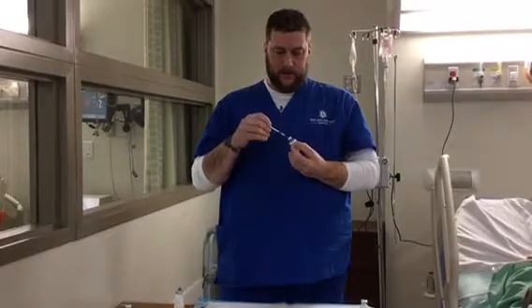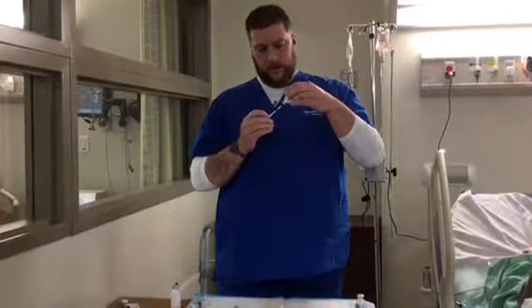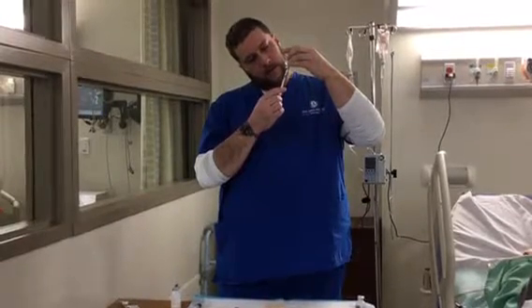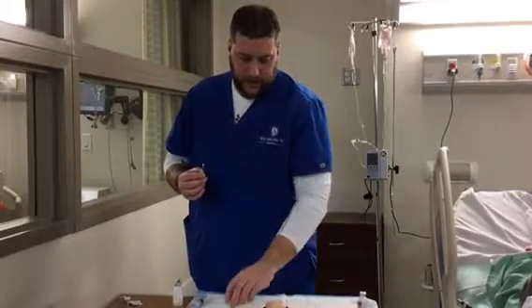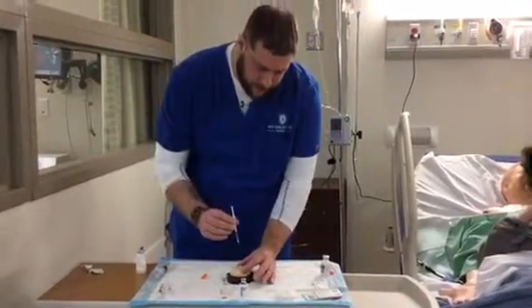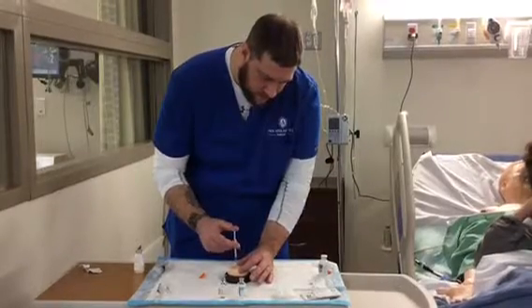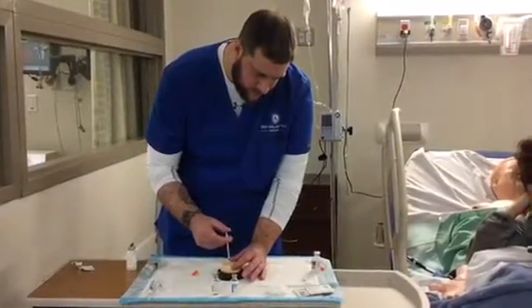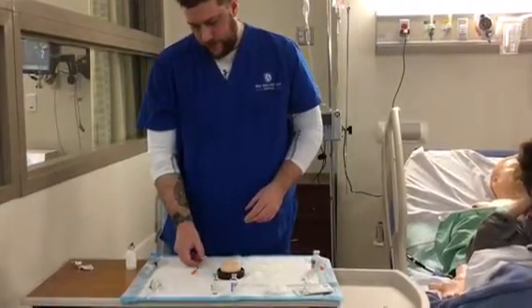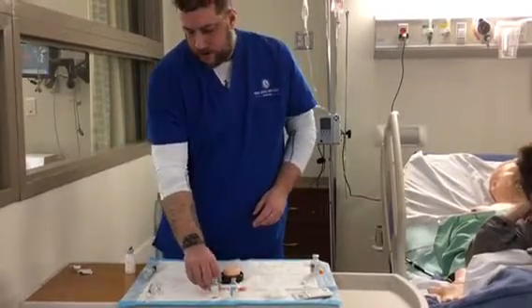So at my 10 units, I'm going to insert. I'm being careful not to get any air. I'm going to add 10 units, which brings me to 20. Withdraw. At this point, it's going to be the same as the intramuscular. You're going to clean the site, wait 20 seconds, and again, going taut, straight in, inject, relax, and straight out. Again, you would not recap, you would dispose of it in the correct location.